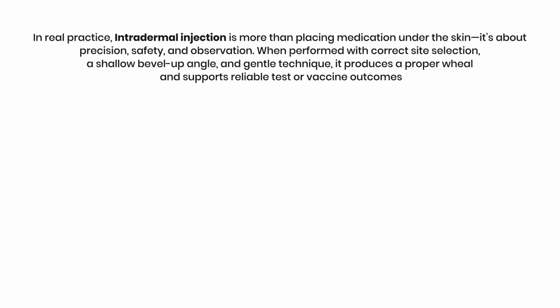In real practice, intradermal injection is more than placing medication under the skin. It's about precision, safety, and observation. When performed with correct site selection, a shallow bevel-up angle, and gentle technique, it produces a proper wheal and supports reliable test or vaccine outcomes.